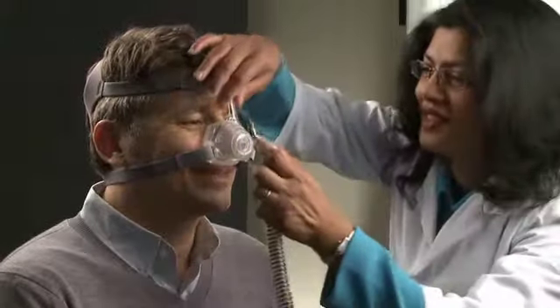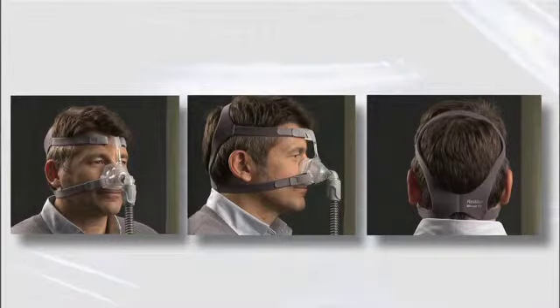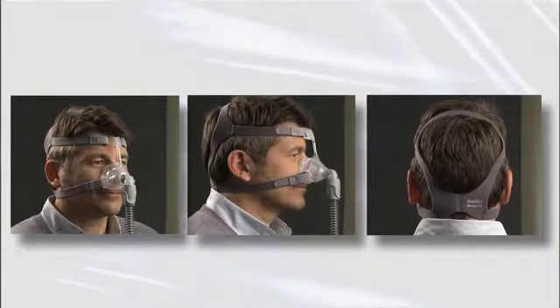Finally, attach the combined elbow and air tubing to the mask by pressing the side tabs and pushing into the mask frame. That's all there is to it. The mask is now fully fitted and should be positioned like this.